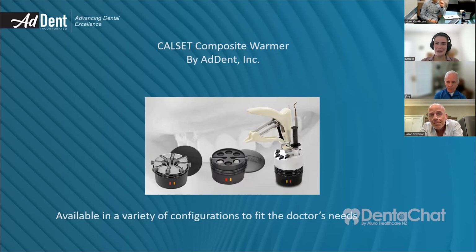Well, you mentioned having the principles and the aesthetics of a packable, but with more manageable flow. We noticed in the last 2 or 3 years that the number of my clients who moved from a packable composite to a flowable composite has massively increased. So question number one is, will you heat a flowable composite?